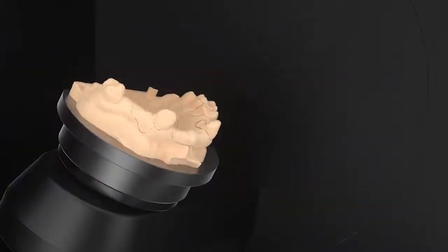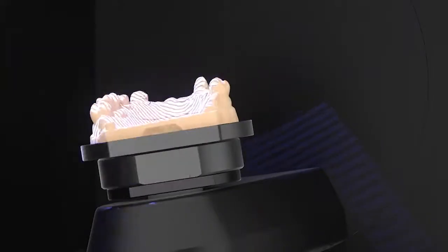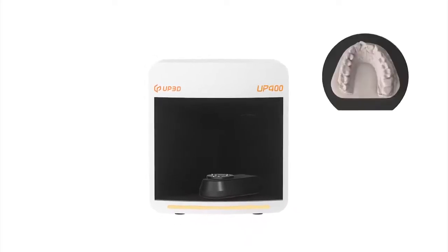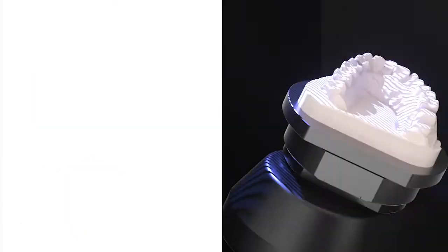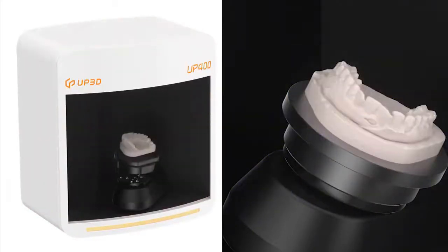We have upgraded the True Color Scanning function, which provides more clear images. It will be easier to design and better to complete partial framework designs. Up400 scans the model without blind angles, and can scan models with narrow gaps, orthodontic, veneer, and non-section models. The incredible scanning speed and reliability help ensure productivity.